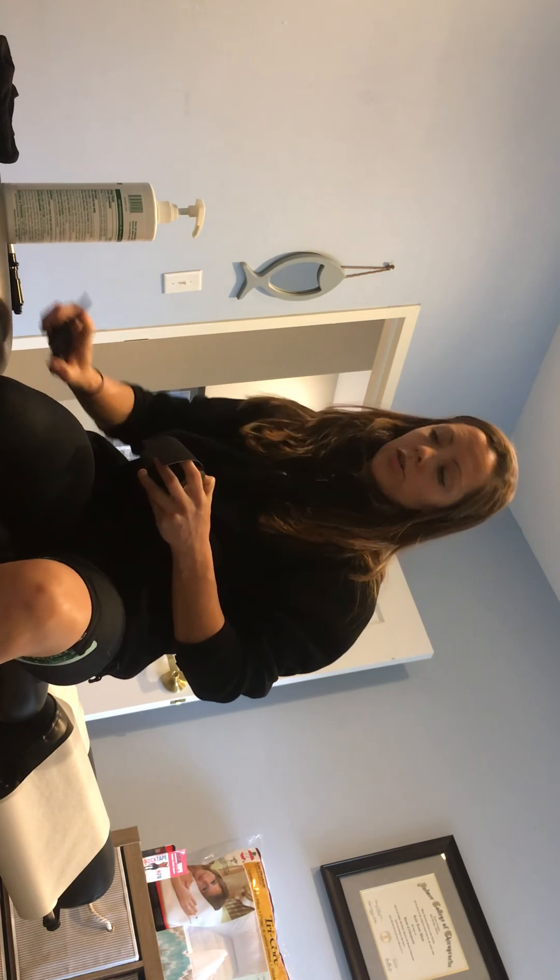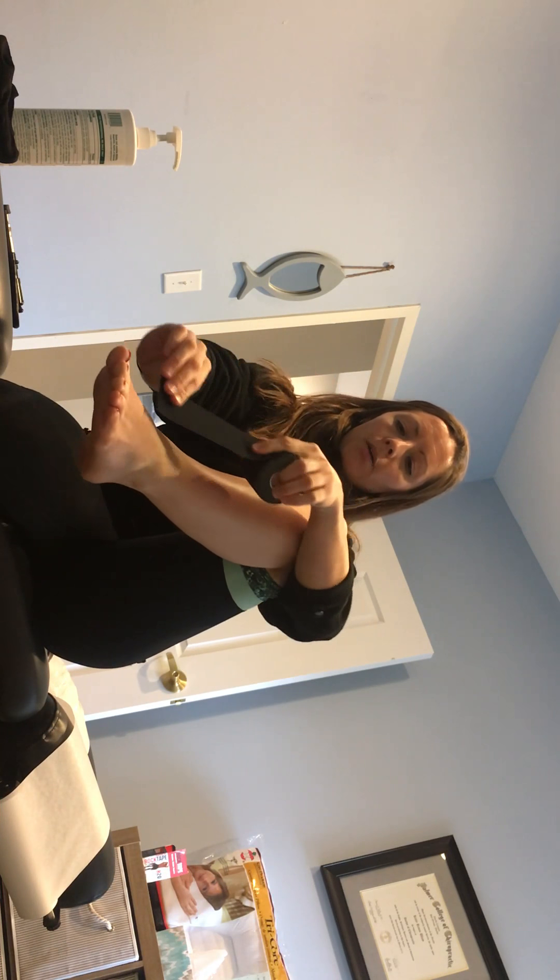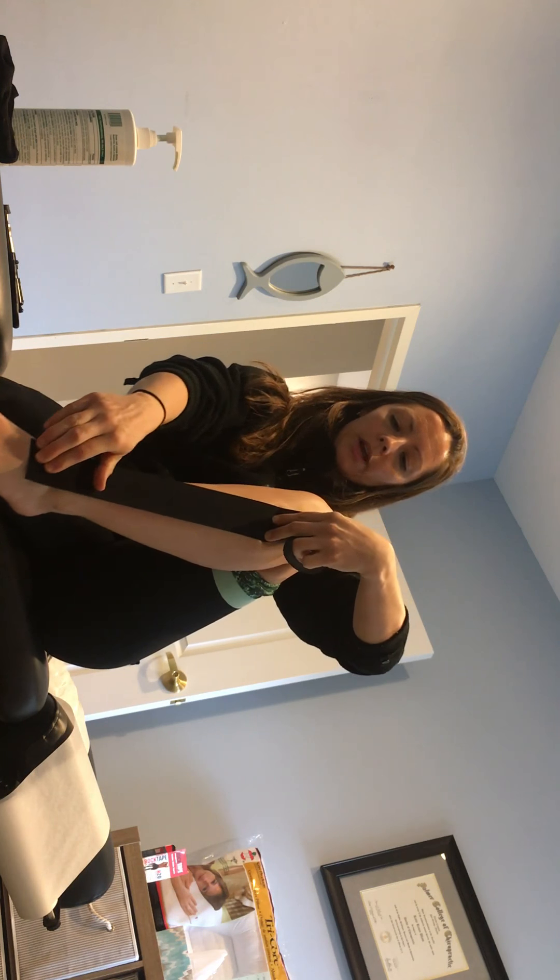Make sure that's dry. I saw a new taping technique that I wanted to try, so I'm going to try it on myself. Literally what I'm going to do is come down all the way into the foot and just come all the way up where I just did that.